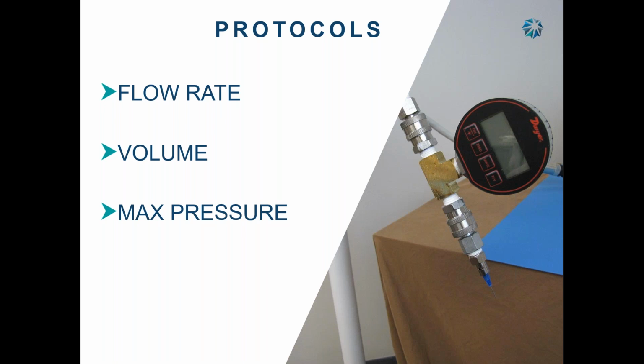I thought it was for a long time, but it's not. Pressure is needed for the flow rate. You set the max pressure so you don't blow up the disposables. Again, I'll get into that a little further when we talk about pressure, of how that can happen and why you have to have a max pressure for the disposables.